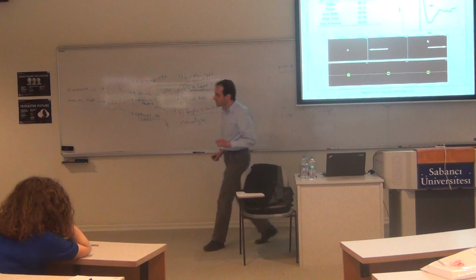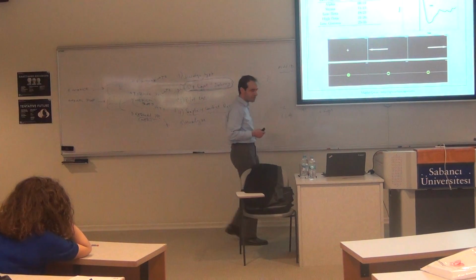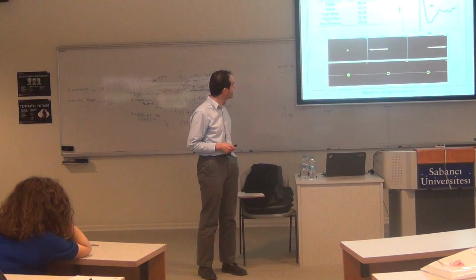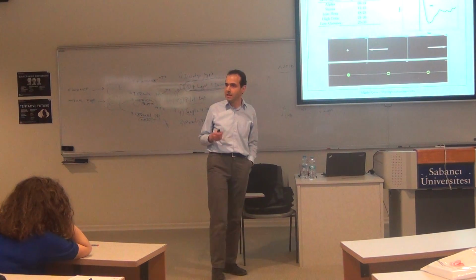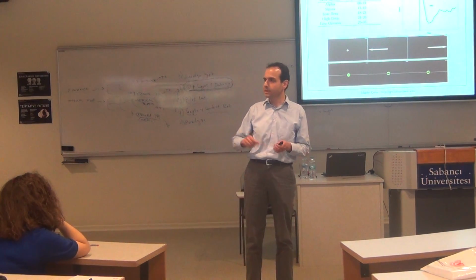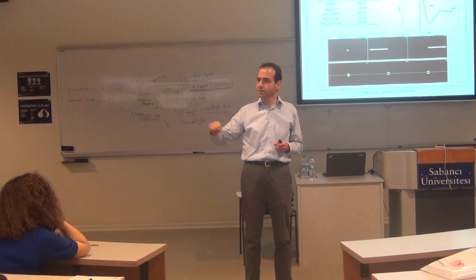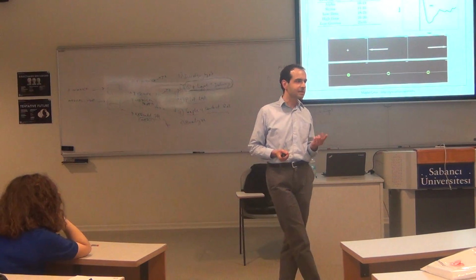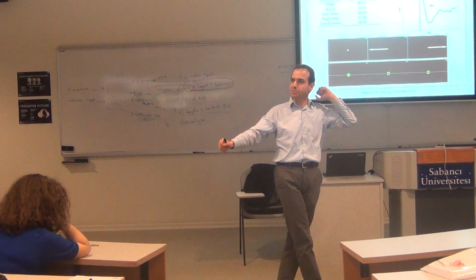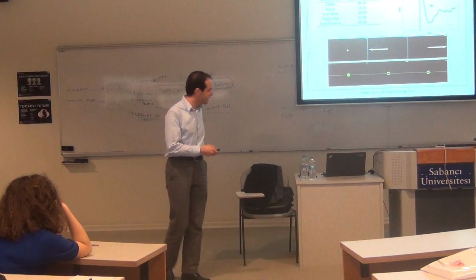So it looks like I'll run over my time, so I'll try to make the rest faster. So up to this point, I talked about P300 as one technique, one type of brain signal for communication. There are other signals. Another signal that can be used very easily are what are called motor signals. So these are things like when I'm in the process of moving my right arm, as I plan, start, and execute this motion, there are changes in the signals, electrical signals in my brain, especially in the motor cortex. When I'm doing a right-hand movement, there are certain frequency changes in the left side of the motor cortex.